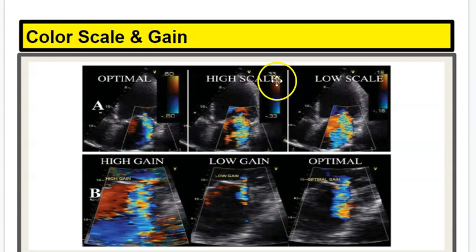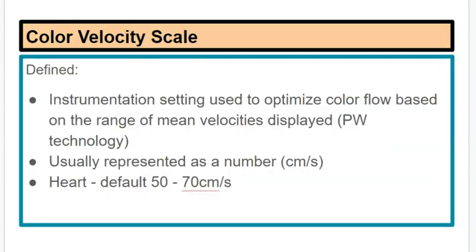So we got to make sure we're able to optimize our settings as sonographers, to have the knowledge base to know how to optimize our settings so we're actually showing the true amount of blood that's traversing the mitral valve into the left atrium during systole.